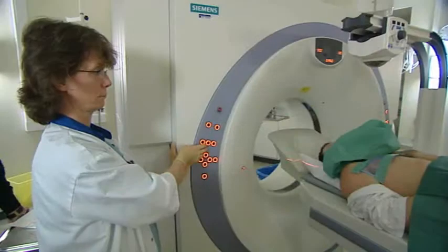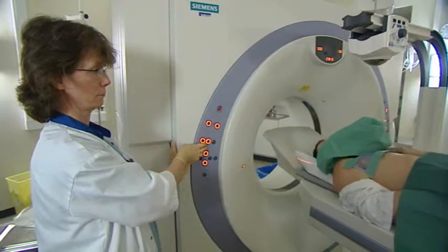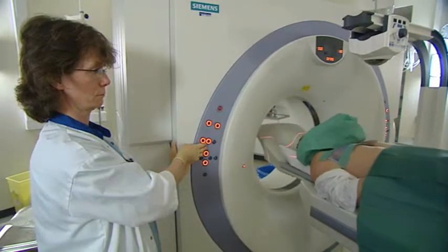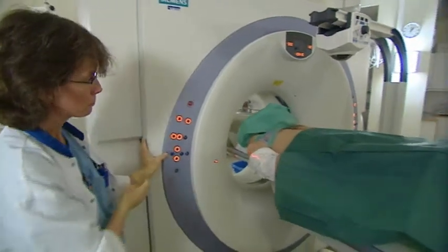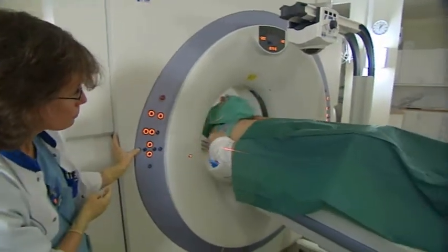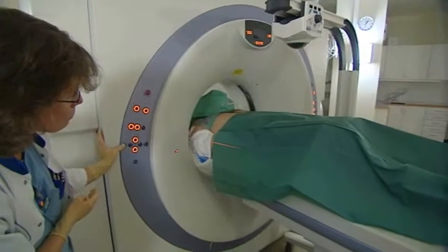The Simplicity can be used with every kind of straight needle or introducer for procedures, such as biopsies, drainages, RF ablations, or pain management injections.